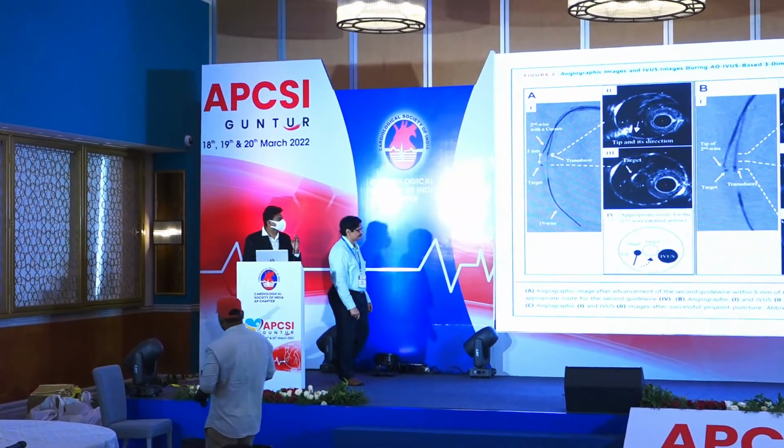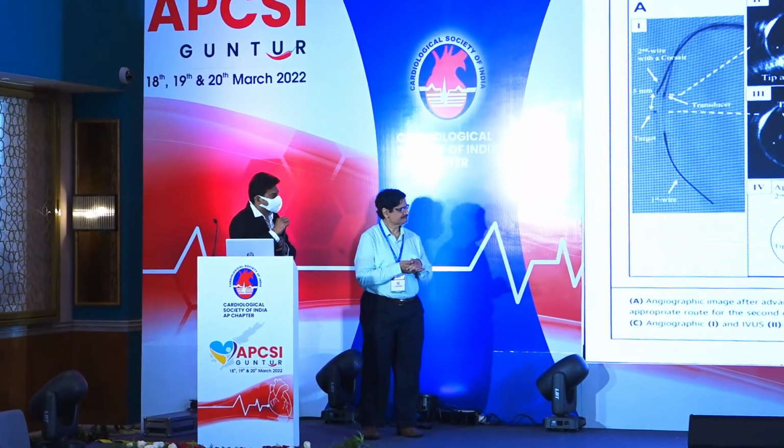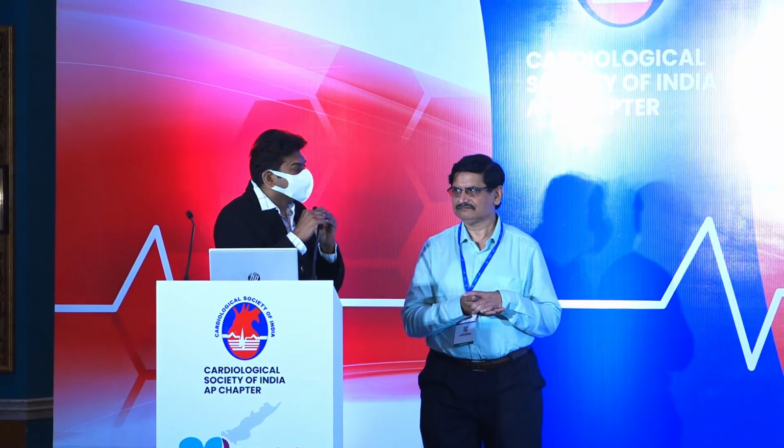Radhikant, last question. For the landing zone of the stent, usually you have shown in the slide less than 50% of the lipid pool and less than 50% plaque burden. But usually people say normal to normal. So do you practically follow landing with less than 50% of the lipid pool?